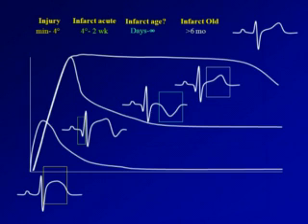By 2 weeks, the ST segment has gone back down to normal and flipped my T wave over. That appearance we know is present by 2 weeks, and it may last forever. So if I see a Q wave with a T wave that's inverted, I say I have a myocardial infarction. I have no idea when it occurred. Infarct, age undetermined. Now if you look at computer interpretation of ECGs for patients that you're dealing with, they probably all say age undetermined. The computer hasn't figured this out yet.